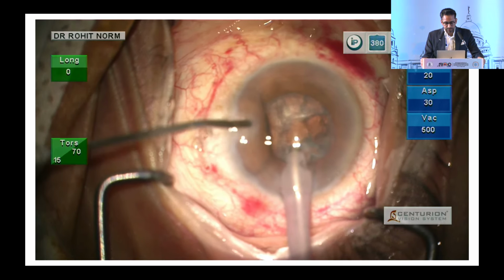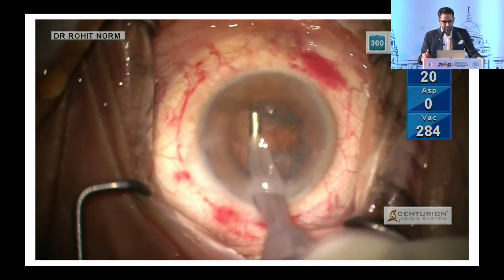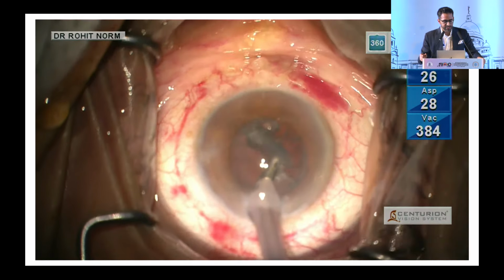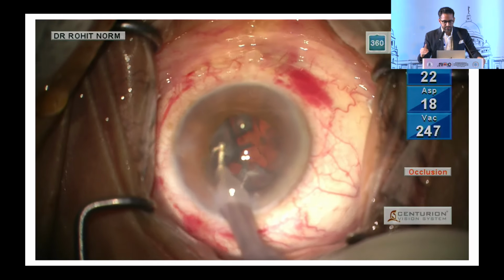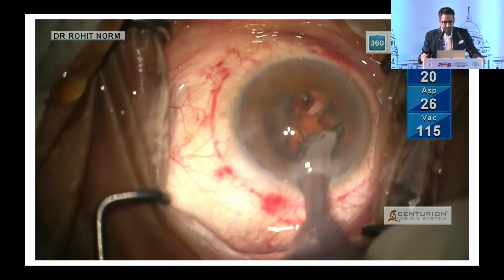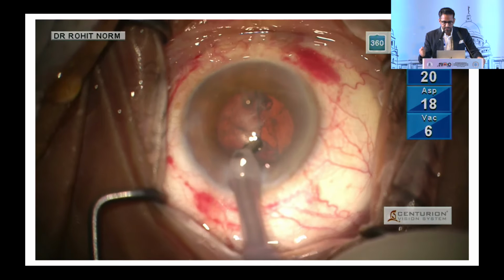So I'm injecting the viscoelastic. You can see the thick epinuclear sheet which is there. So I have taken the advantage of that. Now high sleeve retraction of coaxial IA is done to differentiate the level of irrigation and aspiration. My aim here is to slowly dislodge the epinucleus from all the ends.